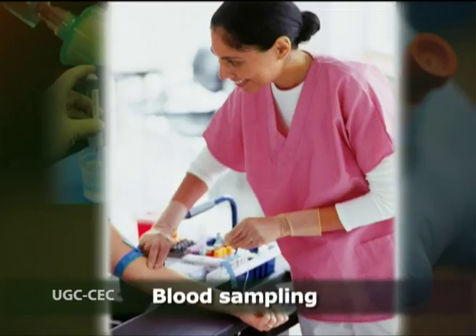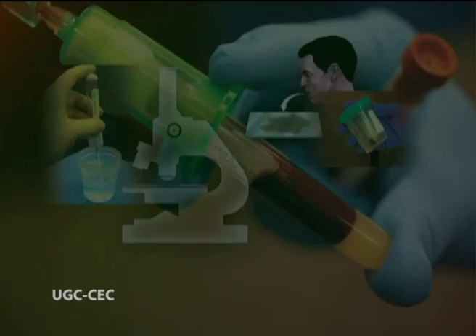Pathological examination of blood. Blood sampling should be performed by a healthcare worker trained and competent in the procedure. As there are many hematological, biochemical, immunological, and microbiological blood tests, the person should seek information as to the appropriate laboratory containers required for specific tests and the amount of blood required.